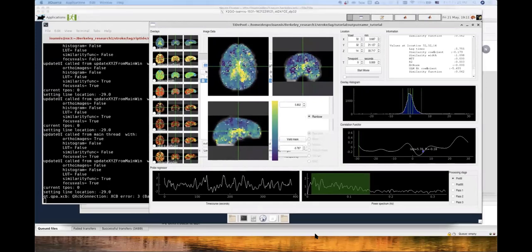Okay, so let's go quickly around this Tidepool visualization to see what we have. The first thing is the lag time. This is the max time map that I just showed you before. It basically tells you what is the time at which the cross correlation with the refined regressor is maximal. You can see a spatial view of the map right here.